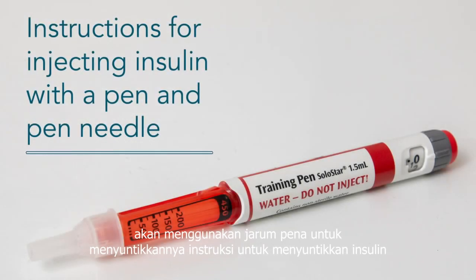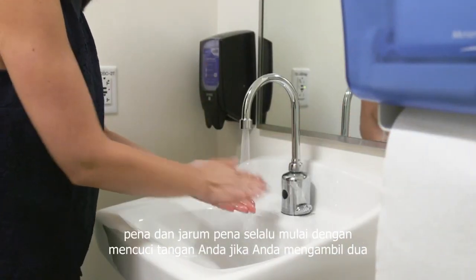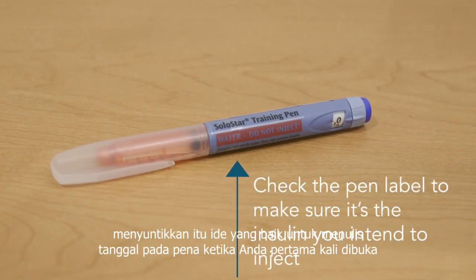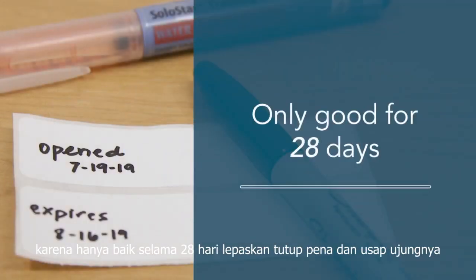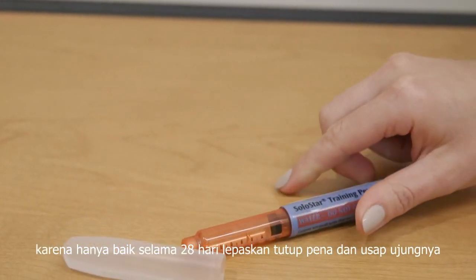Instructions for injecting insulin with a pen and pen needle. Always start by washing your hands. If you take 2 insulins, check the pen label to make sure it's the insulin you intend to inject. It's a good idea to write the date on the pen of when you first opened it, as it is only good for 28 days. Take the cap off of the pen and wipe the tip with alcohol.